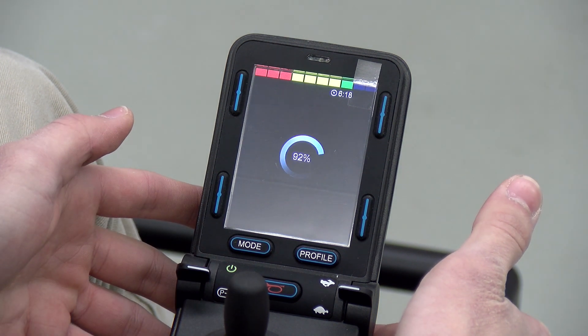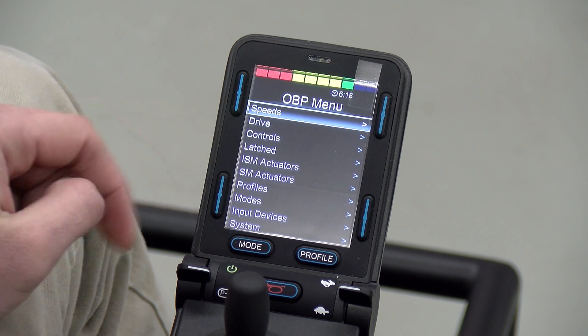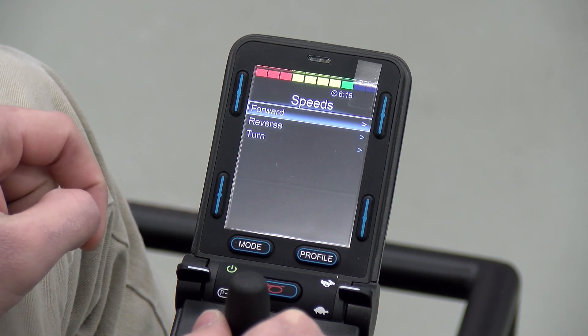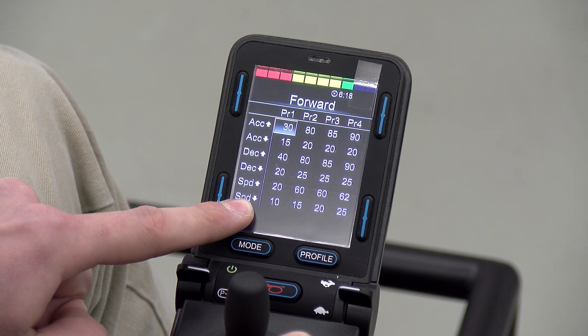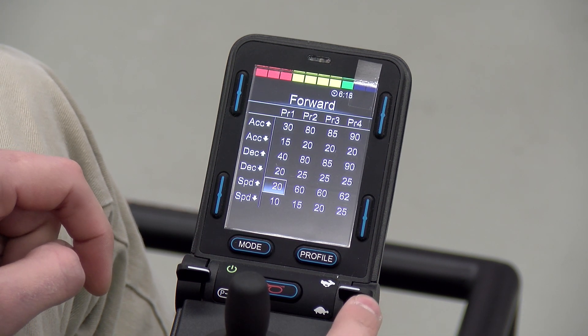Now that we're in the onboard programming menu, we're going to show you how to adjust the speed settings. On top there, go to speeds. You can see we have forward, reverse, and turn. Click on forward and you have your profiles 1, 2, 3, and 4 on the top and 5 is on the right side if you keep going. Using the little rabbit turtle lever on the right side, you can turn these settings up and down.